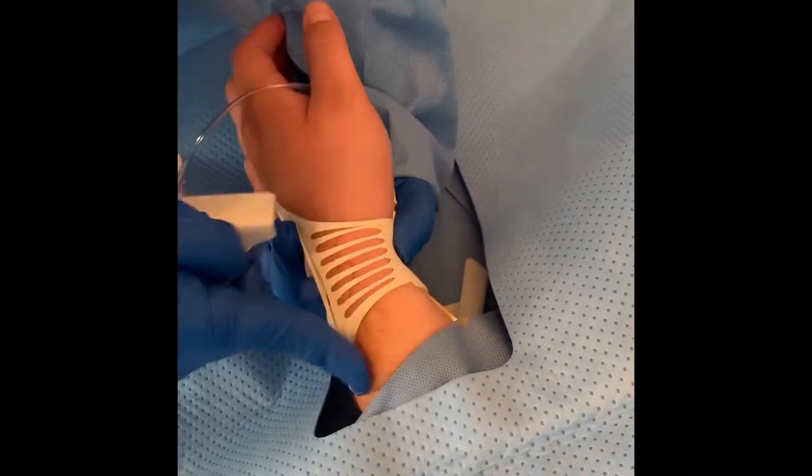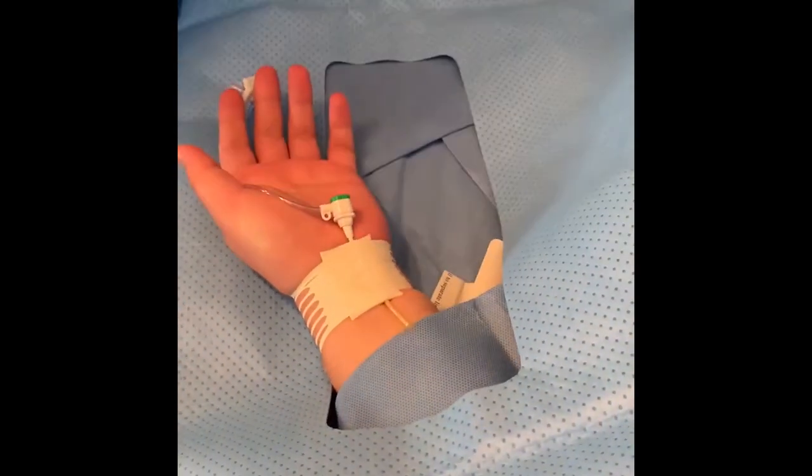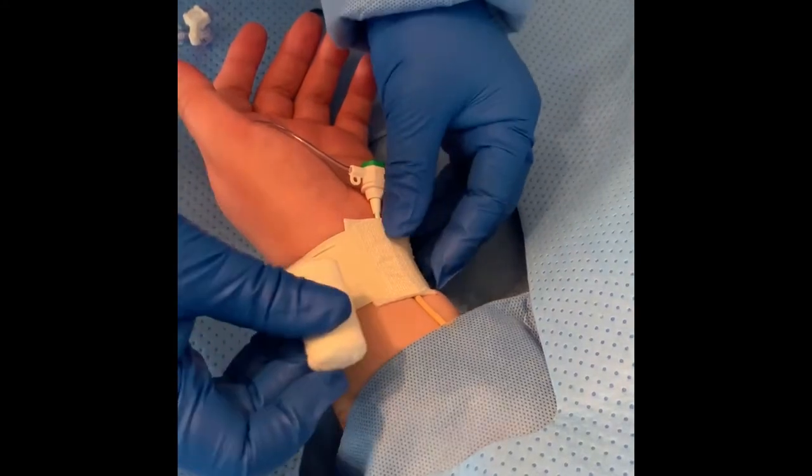Once the white side is in the proper position, remove the rest of the protective sheet securing the bandage. Ensure the catheter is pulled back far enough so that the cap is not interfering with the roll being placed over the puncture site.